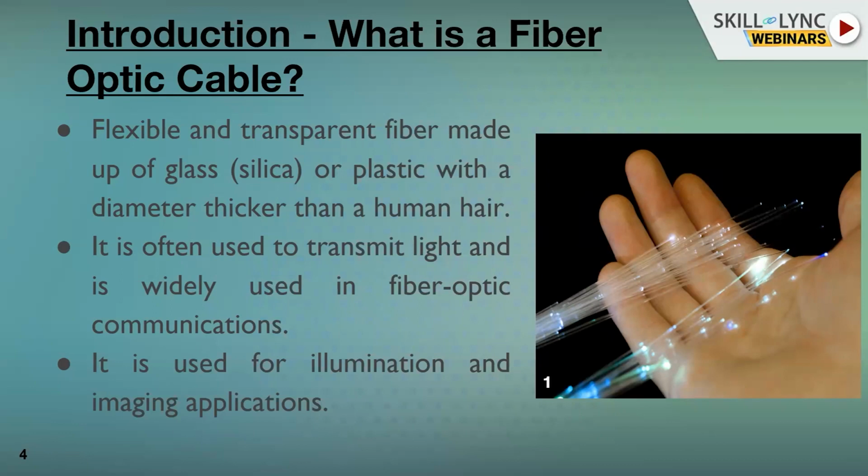So what is illumination purpose? It can just be used as lights. Maybe you might have seen in your hometowns or in homes, we use a decorative tree, which is also a kind of fiber optic cable.